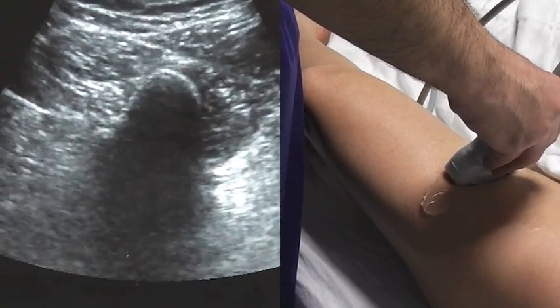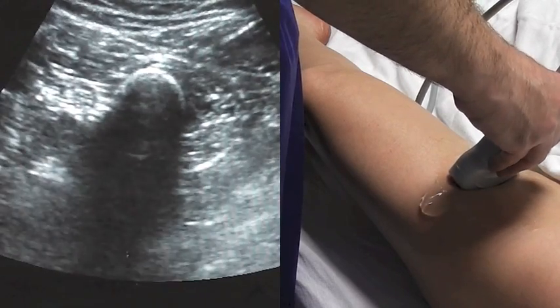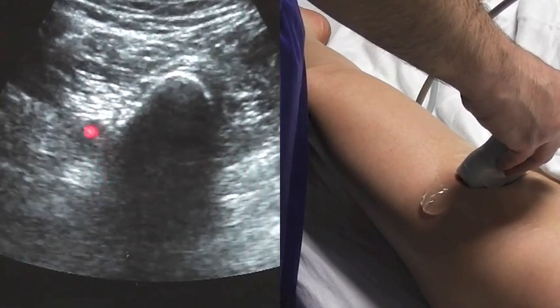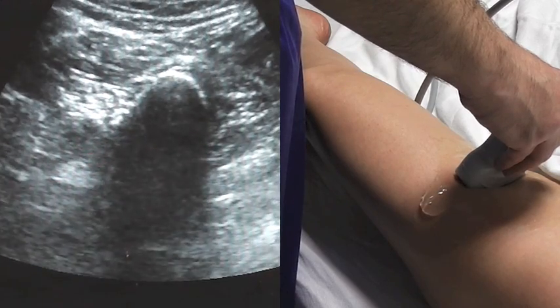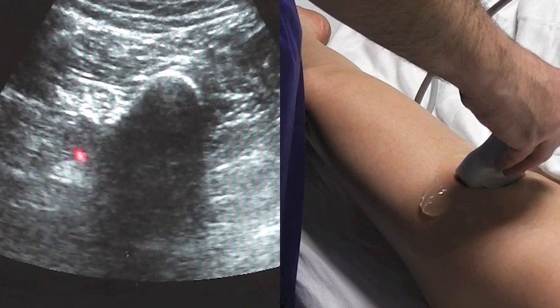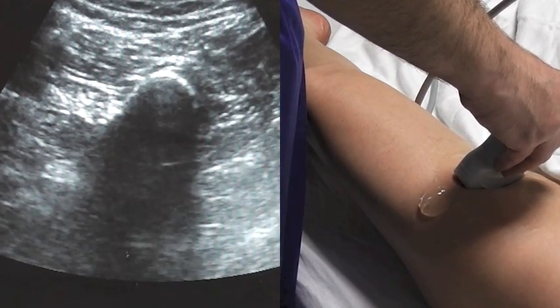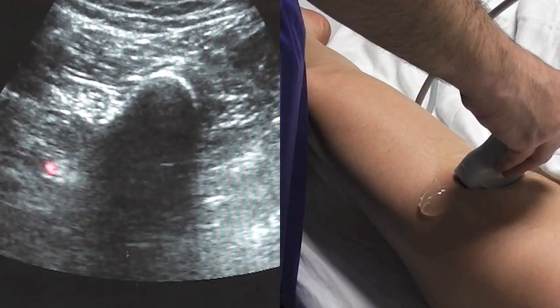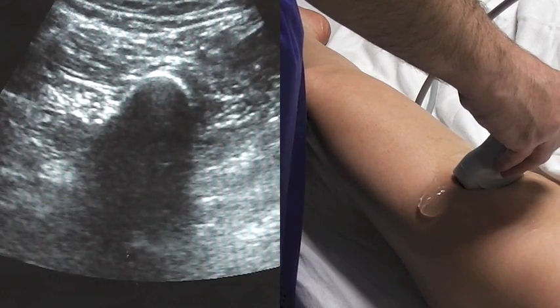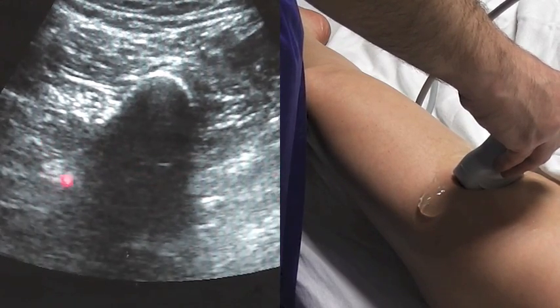What I'll often do is maximize my view, get to where I feel the nerve is going to be — in this instance it looks like it may be right here — and come out of plane using a nerve stimulator. I'm also going to make note of how deep I think this roughly is. On the setting on this screen we are at about 11 cm, and the nerve is sitting at about 6 cm.